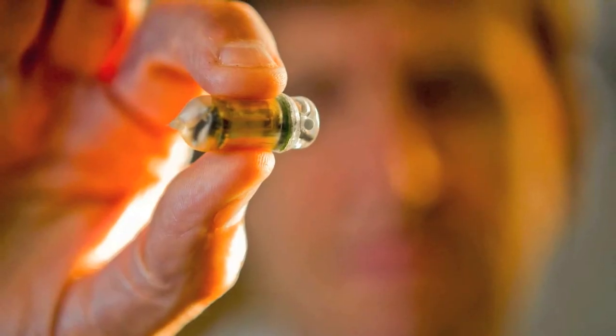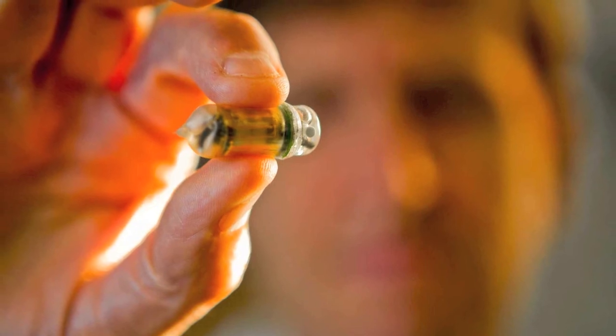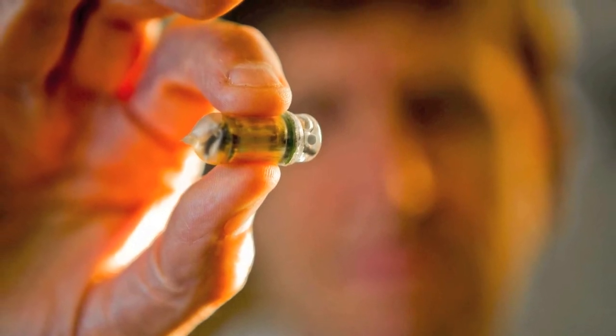We only have a few months or a couple of years of experience with a capsule. We have 20 years of experience with manometry. I would like it to establish itself as a valid, reliable technique that is as good as the technique that we have used for the past 20 years.